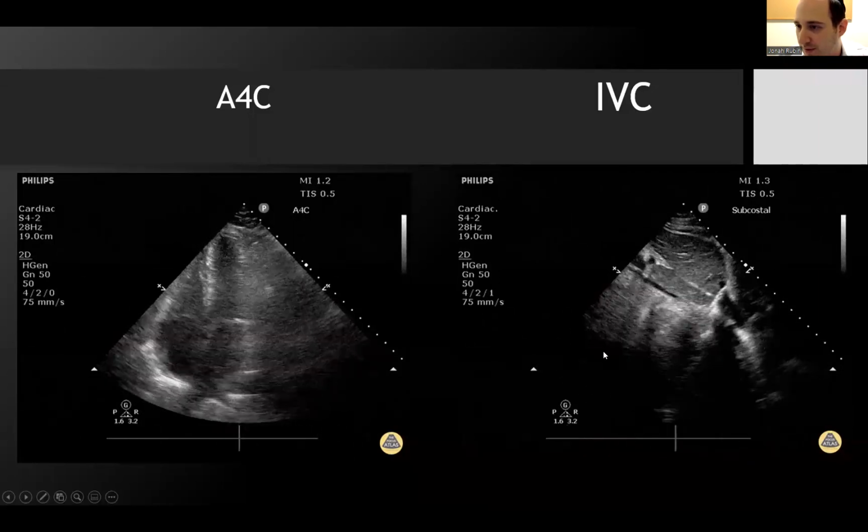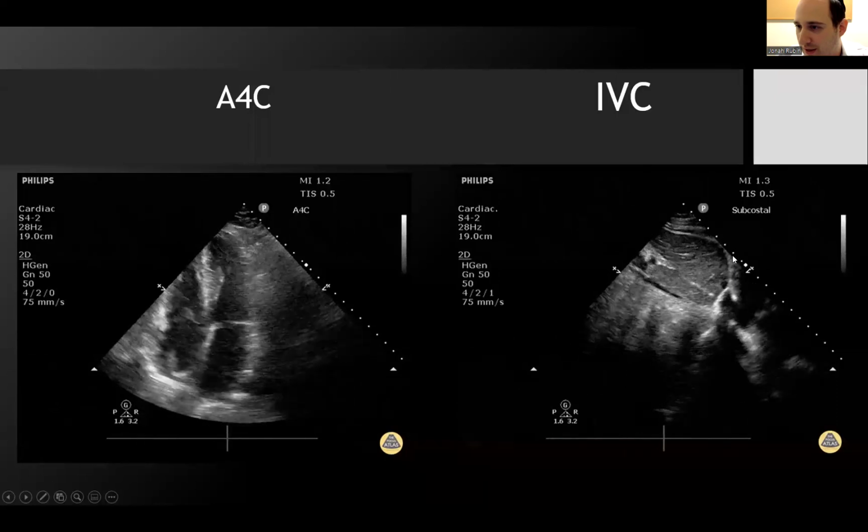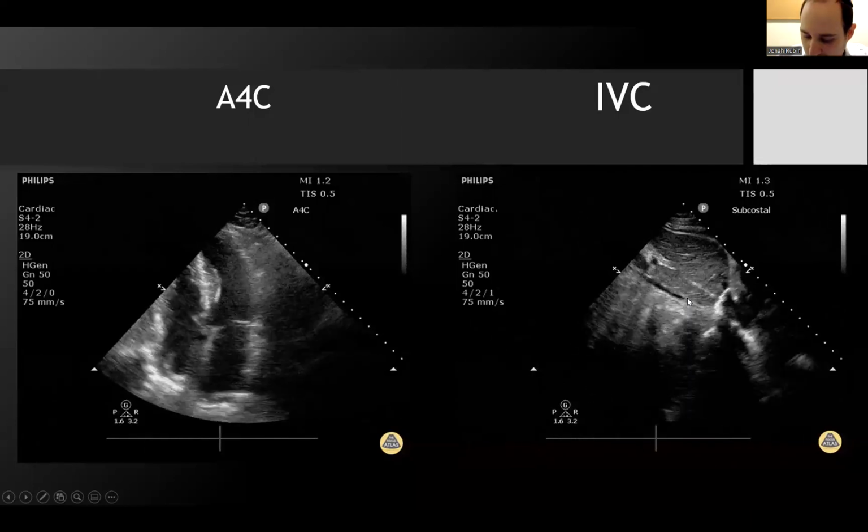I completely agree with you. This looks thinner than this. So it's less than 1 centimeter, so small and collapsible. And while I dislike the IVC most of the time for most reasons, this at least will help you think what in this case?